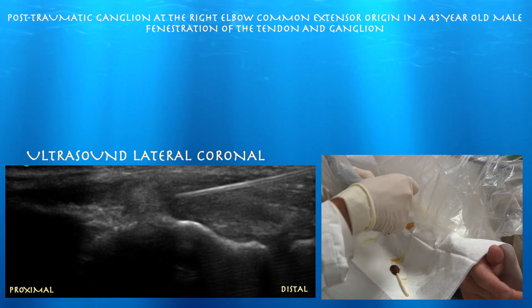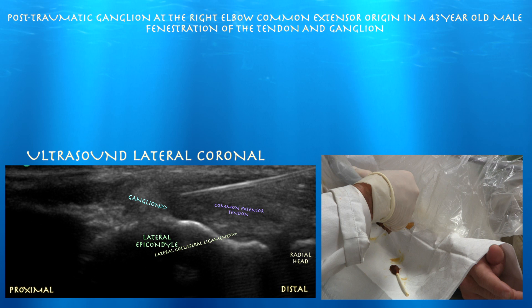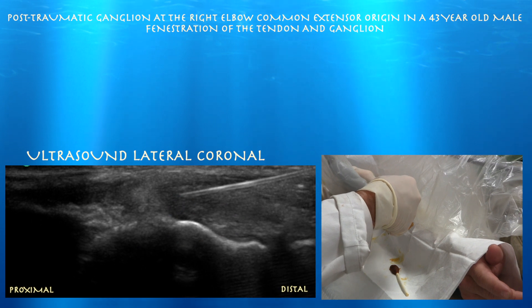In this procedure, we really focused on the ganglion. We did do somewhat of a tenotomy as well just to get to the ganglion, but we really just tried to break up the wall of this ganglion with the needle, and hopefully that will soften it up and decrease his pain.